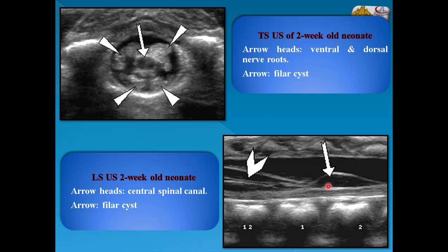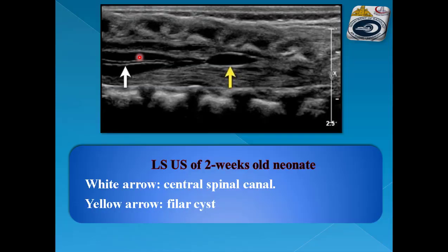This is an example of a filar cyst on LS ultrasound examination and TS. This is the cyst just below the conus medullaris — to differentiate it from the ventriculus terminalis, note that it is outside the conus medullaris. This is the central spinal canal shown on TS.